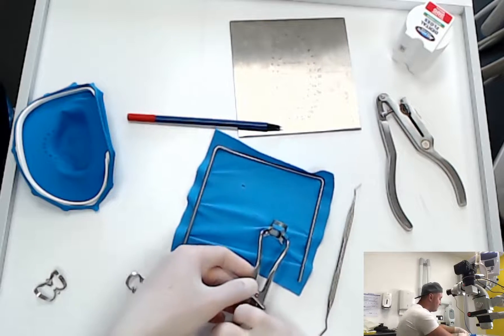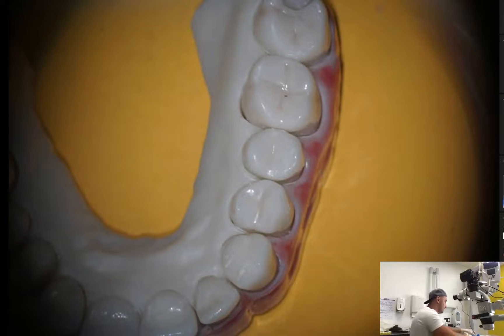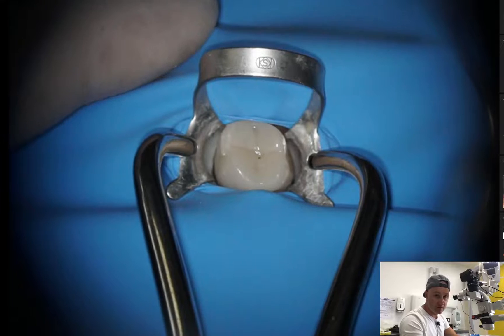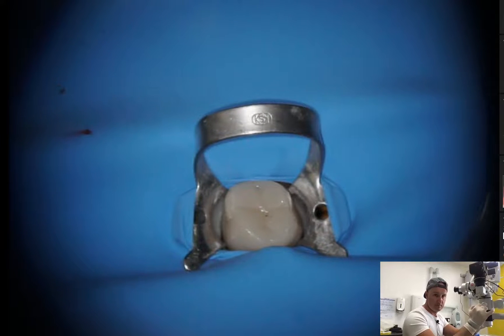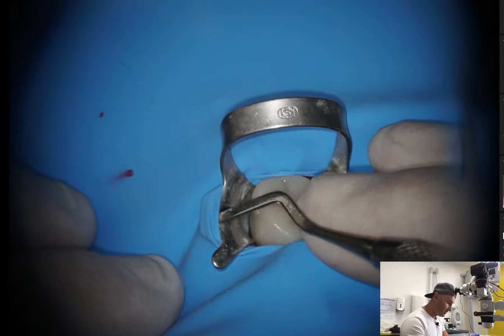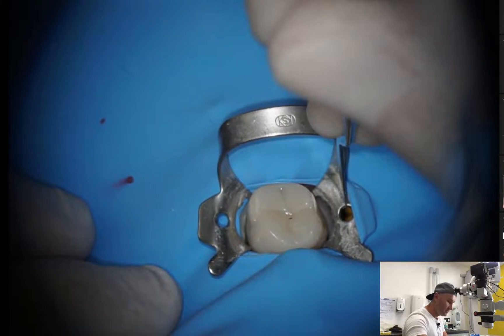When you have everything ready, take your forceps like this and go to the patient's mouth. Release the forceps and place the clamp on the tooth very easily. Then take your composite applicator and release the rubber from the wings of the clamp, putting it underneath very easily.